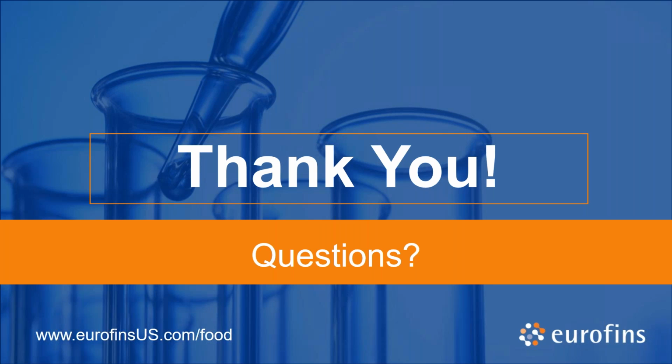You run that by the rapid method and the reference method alongside one another, compare the results, and if they give you the same detections, your validation is done. It's a little more complicated in practice because hitting those exact fractional levels is tricky, so you probably end up doing more than 30 samples, but broadly speaking, that's the approach. Now, if the overall matrix has been validated, but you're in an adjacent category, you might not need quite so much work. But it's basically all there in Appendix J.